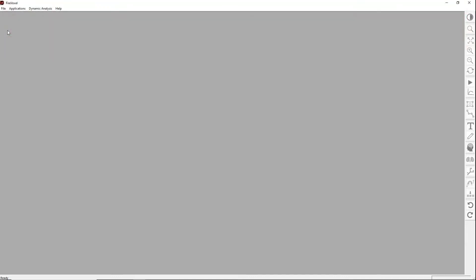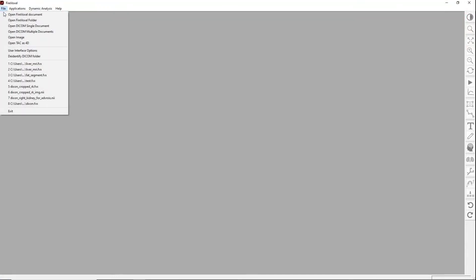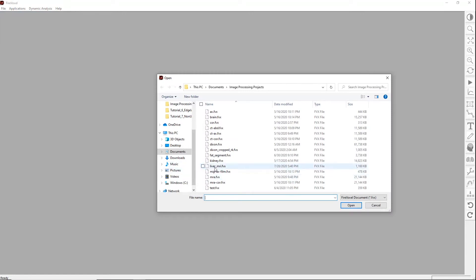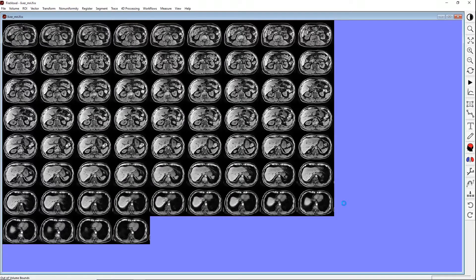We will start with an example of a non-uniformity artifact in liver MRI. Open a document with MRI images of the upper abdomen. This T1-weighted VIBE dataset has a noticeable non-uniformity artifact. The image is darker in the front and center of the abdomen and brighter towards the sides of the body. This artifact is particularly pronounced in the liver.